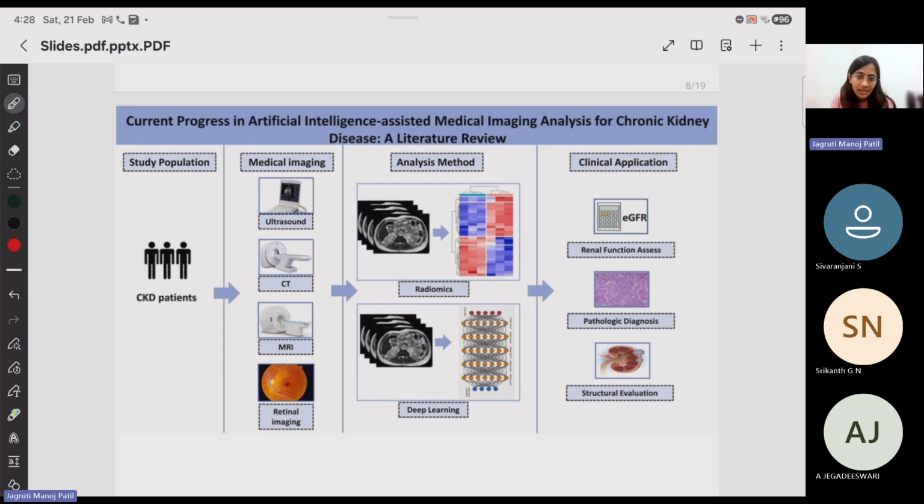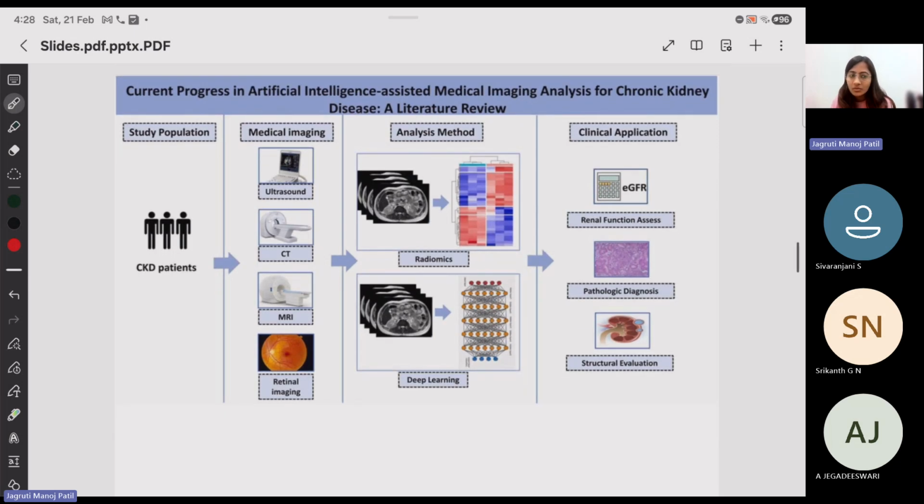This is one such case study for chronic kidney disease. There was a study population, and they did all these imaging modalities. They got data from all of them and did pixel based analysis and voxel based volumetric analysis. Radiomics here basically means that you have all the scattering features, all the Hounsfield units based on CT, X-ray attenuation coefficients based on CT, and cross-sectional attenuation.